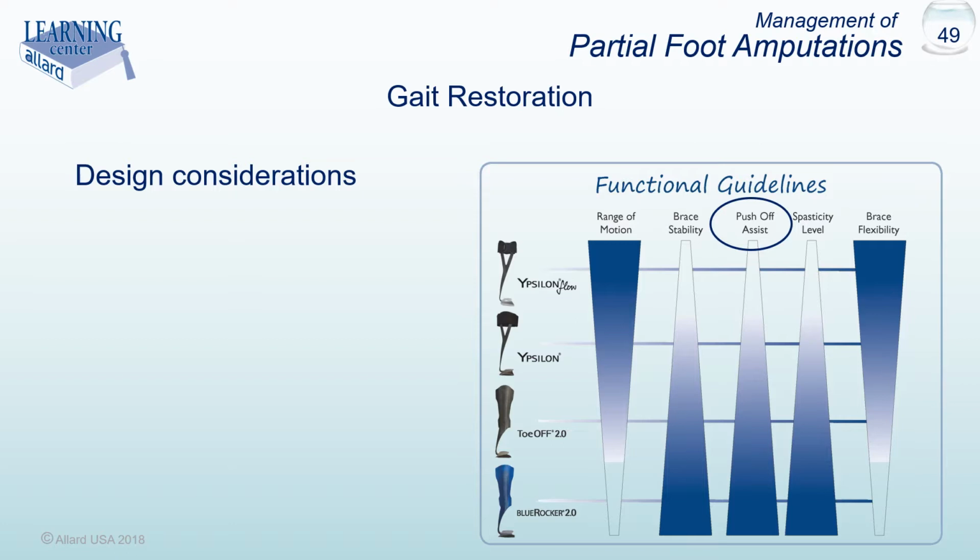It's usually worthwhile checking gait in 2 or more of these devices to assure the patient is getting the right amount of dynamic response to match their functional needs.